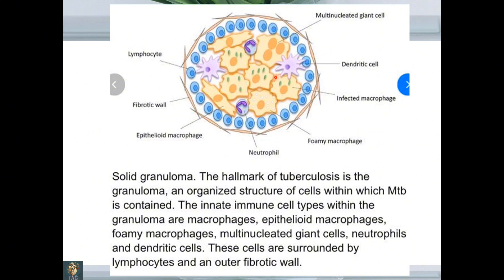Please concentrate: the outermost layer is fibrotic — fibrous tissue — followed by lymphocytic infiltration, the blue layer representing chronic inflammatory cells. Along with macrophages — foamy macrophages and epithelioid macrophages — and multi-nucleated giant cells, these are the hallmarks for granuloma. To diagnose it histologically, these multi-nucleated giant cells are called Langhans giant cells in tuberculosis.